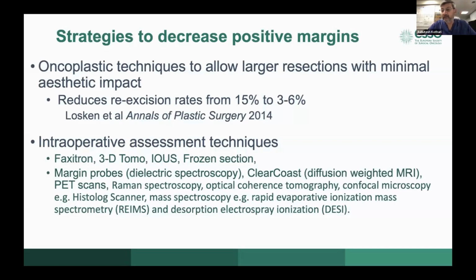And then, of course, you have intraoperative assessment techniques, which have things like X-ray, which is what 46% of you guys use, intraoperative ultrasound scan, which again more people use. We have frozen section, which is the second largest choice in today's poll.